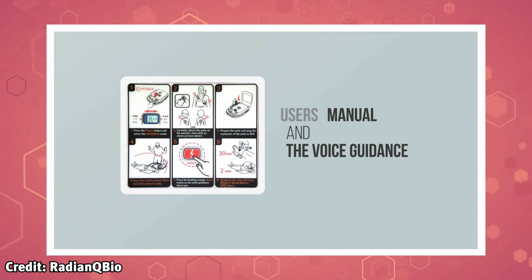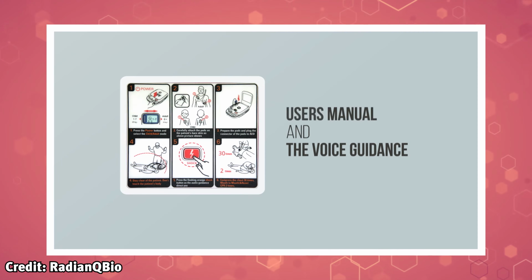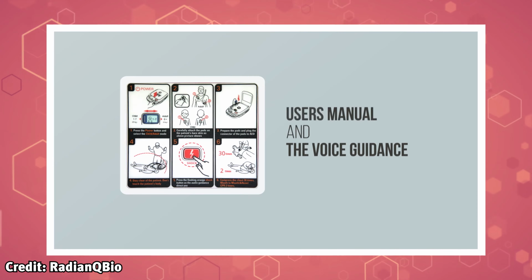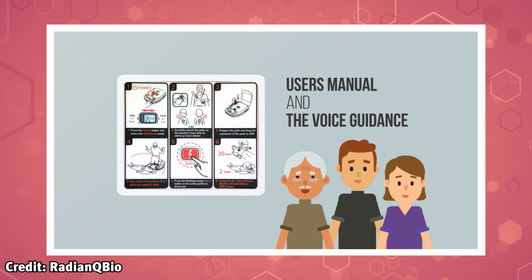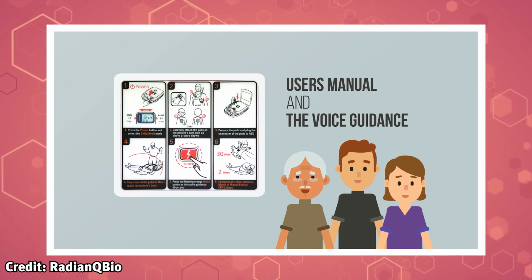So let's walk through this device step by step, so if an incident does happen, we will all be prepared to help out in the event of an emergency. First, keep in mind that most AEDs have clear voice and visual instructions, walking you through each step of the process. This allows anyone to use the device, regardless of training, age, or experience.